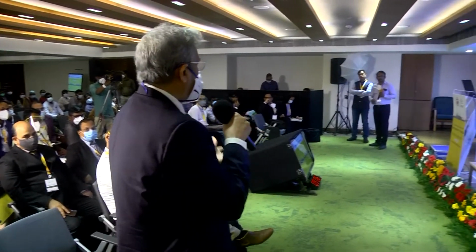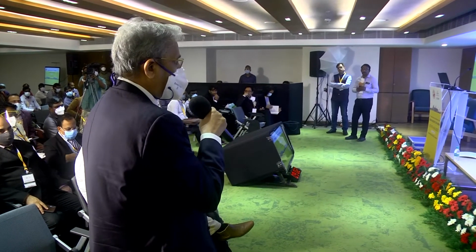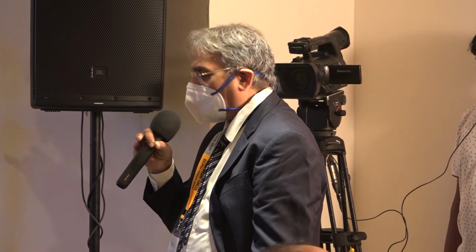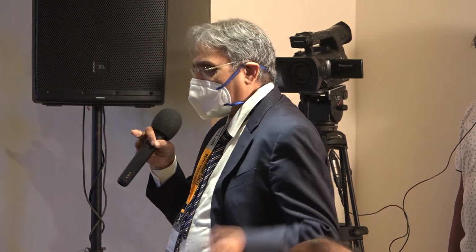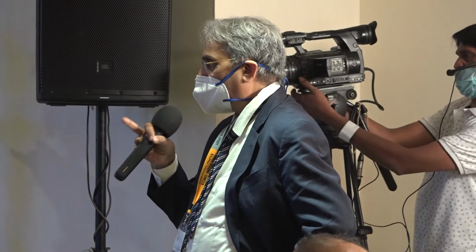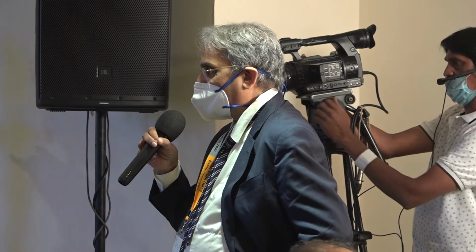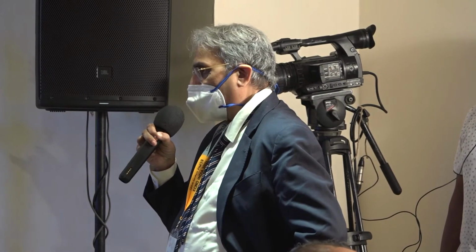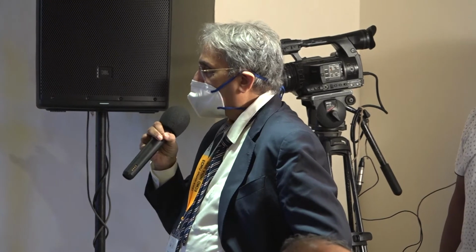Majority of pre-op patients, at least the ones we have done, are transplant candidates. That's why they are listed and they're waiting. And we have done, I think, now 7 or 8 VADs from ECMO to long-term VAD. Long-term VADs are expensive. It's, as you know, 1 crore plus. Now that Medtronic is off the market, the cost is an issue. So what we find is, beyond 2 or 3 weeks, recovery slows down on ECMO. You suddenly have a cerebral bleed or something, the whole thing is over. So we transition to a short-term VAD, and our outcomes are better if you have a VAD after ECMO at the time of transplant, as compared to running on ECMO for 6 weeks, for instance. But in general, availability of affordable VADs will dramatically increase the survival to much beyond 70–80%.